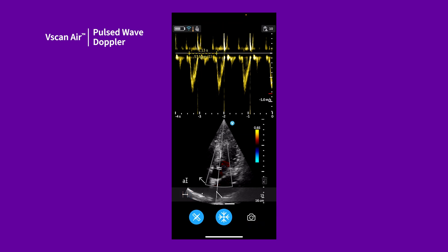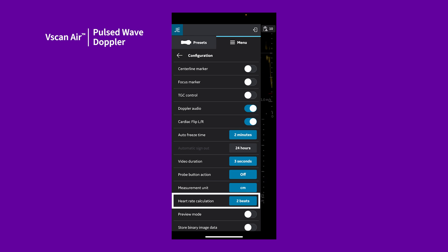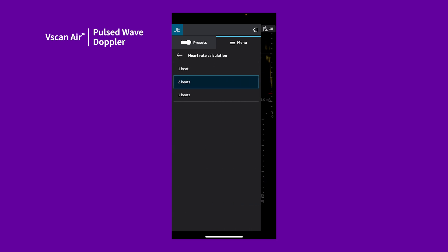Tap the store icon to save. You can adjust the number of heart beats used in the calculation. Swipe right to access your menu, tap Configurations, then tap next to heartbeat calculation to select the number of beats.